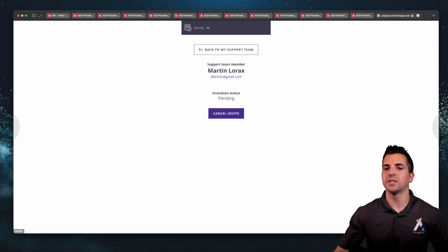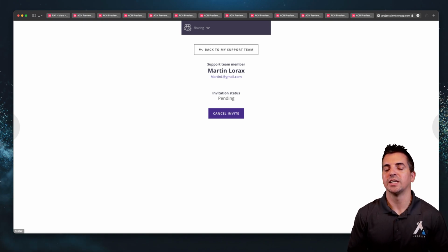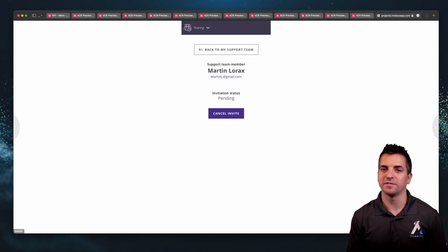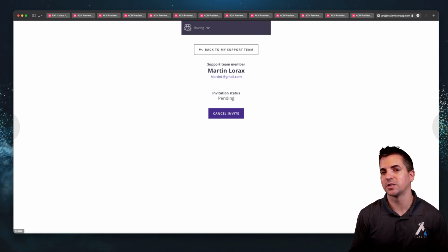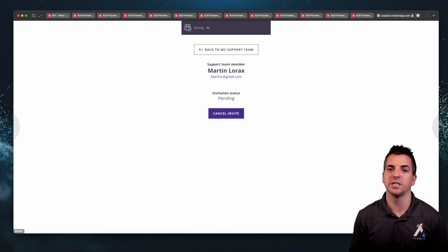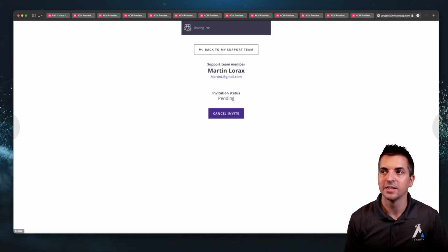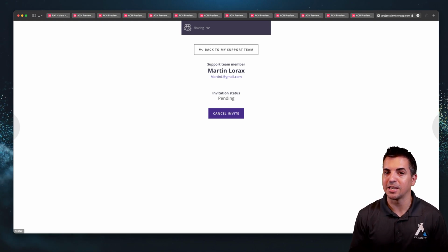Now, ultimately, the big thing we want you to take away from this whole process of secure sharing is that this can be used for a lot of different scenarios. We just went through a detailed scenario looking at a glucose meter with Bluetooth interactivity with a mobile application, a tablet application, and a web application, as well as a desktop application, actually. So it has all of those different omni-channel device types, if you will.